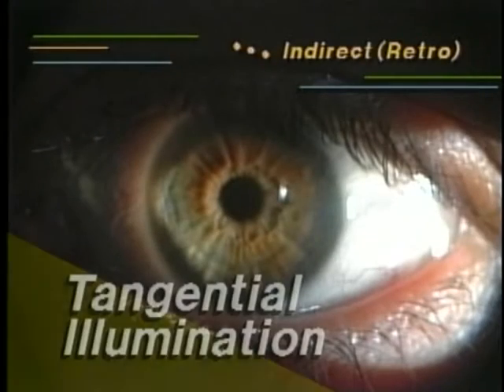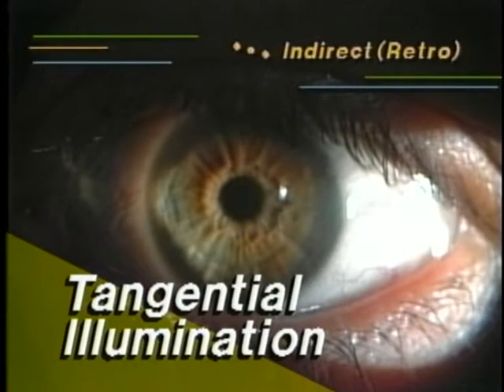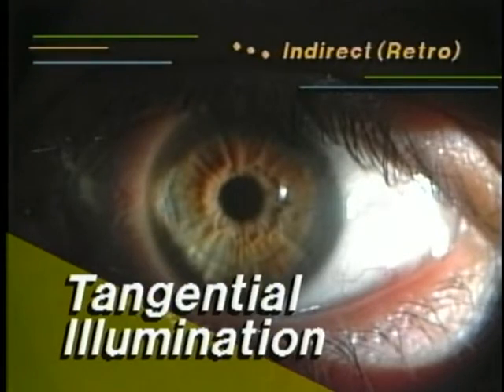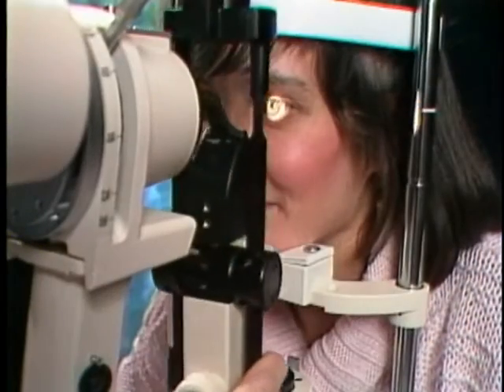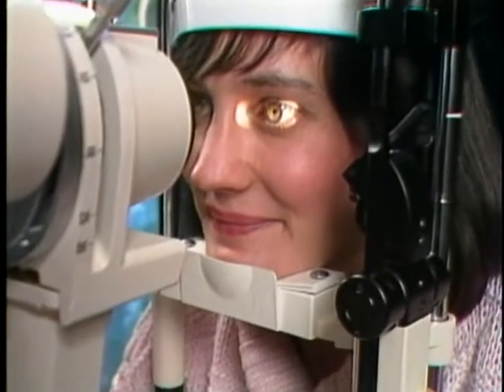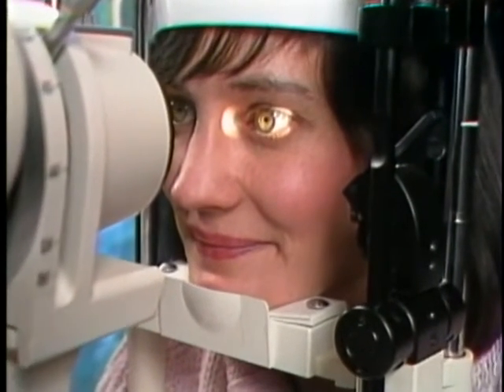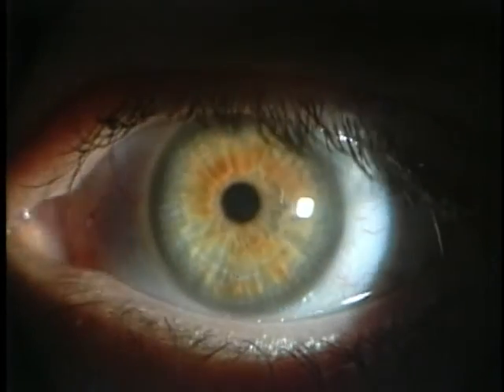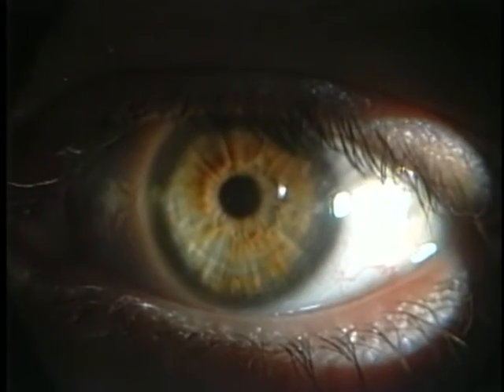Another useful illumination is tangential illumination, which uses a broad diffuse beam. The microscope is focused on the cornea, and the illumination system is positioned at the temporal canthus. The light source is focused near the limbus, and the iris and cornea are obliquely illuminated. This view enhances the surface details of the iris.